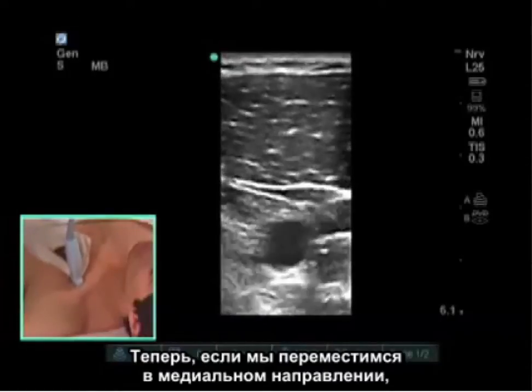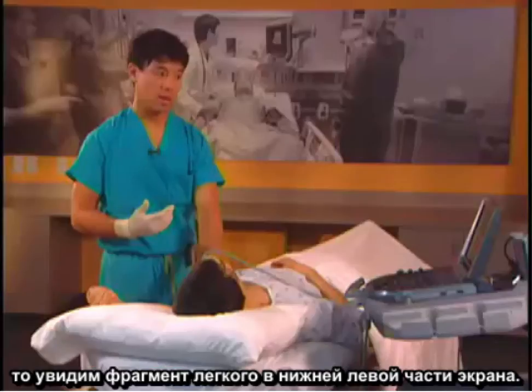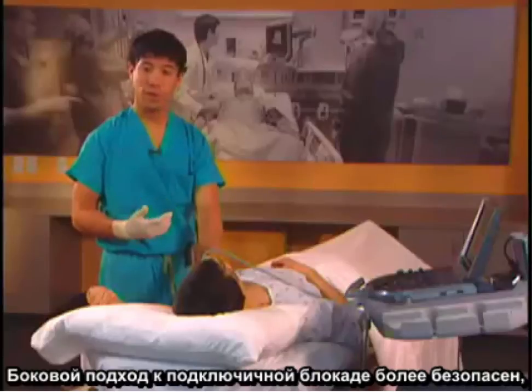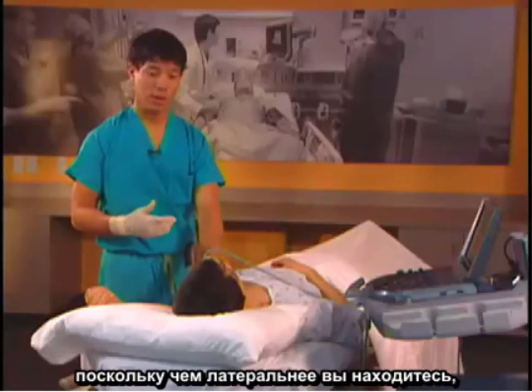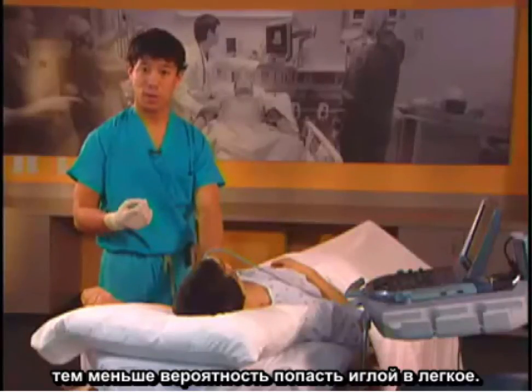If we move more medially we see some lung on the bottom left side of the screen. Lateral approaches to the infraclavicular block are safer because the more lateral you are, the less likely you are to enter the lung with your needle.